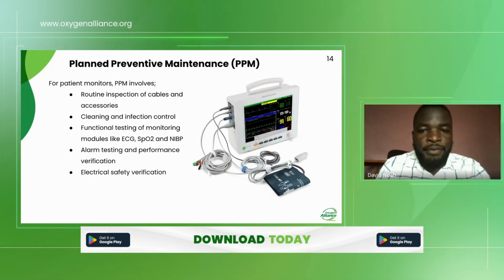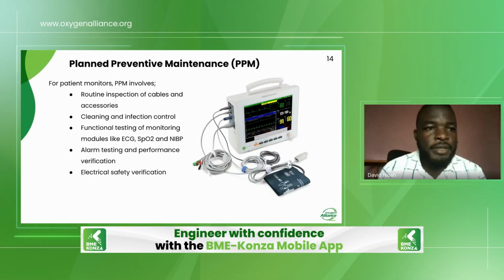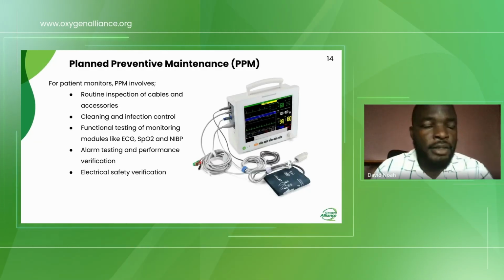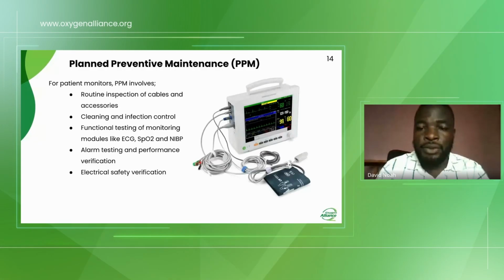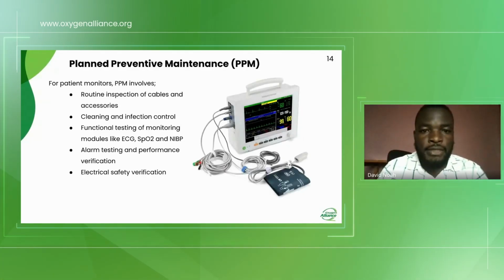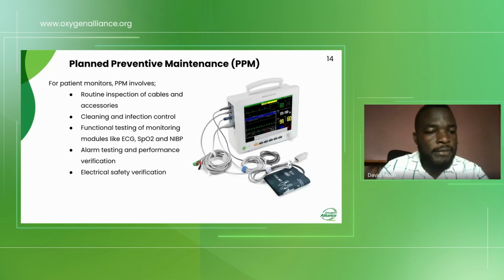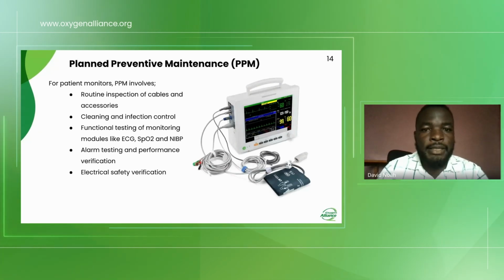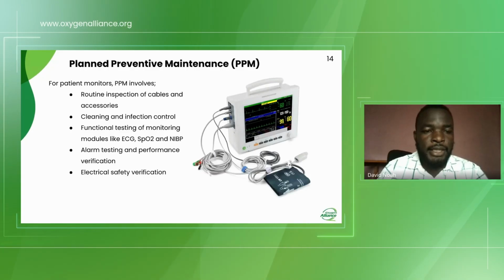Planned preventive maintenance is one of the most important responsibilities of the maintenance personnel in hospitals, especially for patient monitors, because these monitors are continuously used in critical care environments, for example, the ICUs, theaters and HDUs.